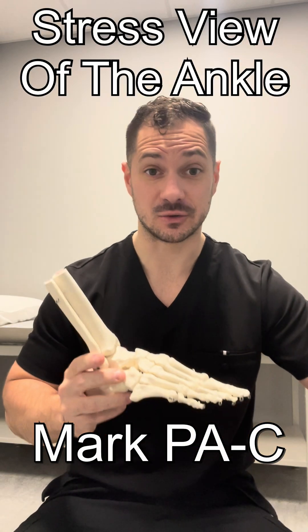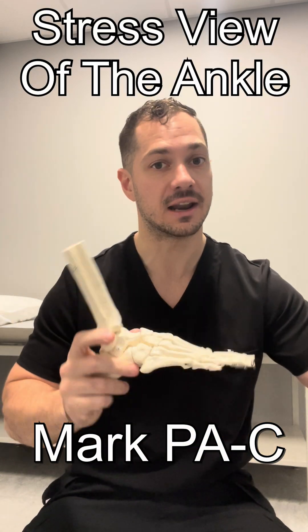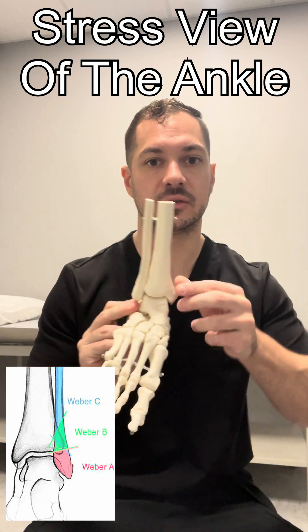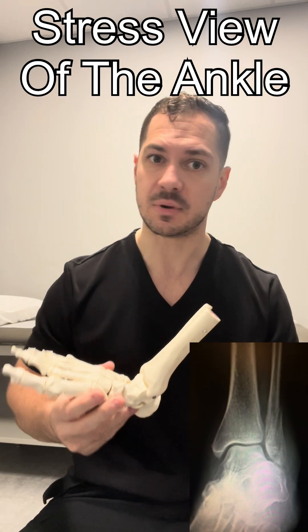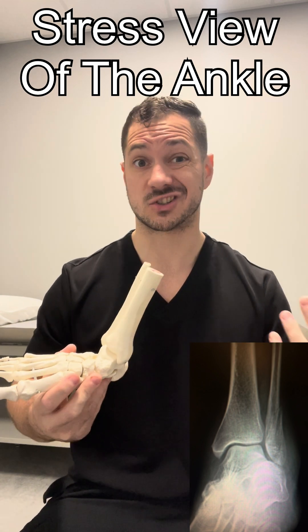Hey everybody, so today we're going to be teaching you all how to do the stress view of an ankle on x-ray. Indications to perform a stress view is usually a Weber B fracture. A Weber B fracture can or cannot be unstable and may require surgery.